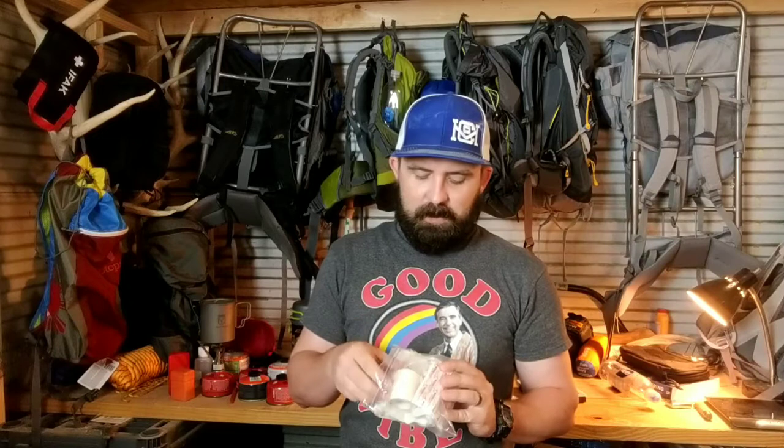As many of you may recall, I tell you to pack your first aid kit in a sandwich baggie. This sandwich baggie has all the goodies that you need. Like I said before, I've got a glove so that I don't get all kinds of nasties on me when I'm doing this kind of thing. And the most important thing for improvising a chest seal, we've got some tape. And then we've got the bag itself. The bag itself is the magic key to this, and it gives us the opportunity to create a chest seal to help our person with a sucking chest wound deal with that horrible event. So without further ado, let me show you how to get it done.